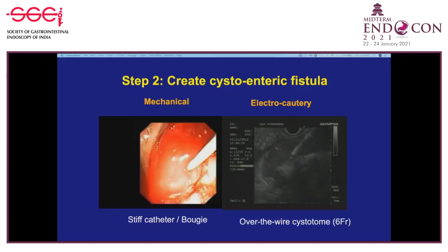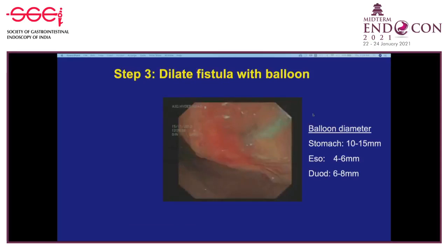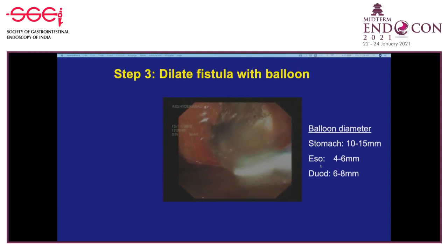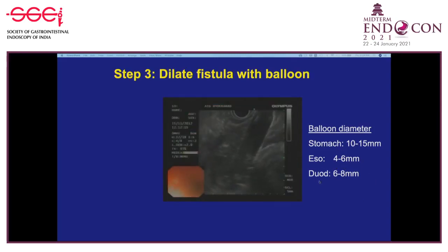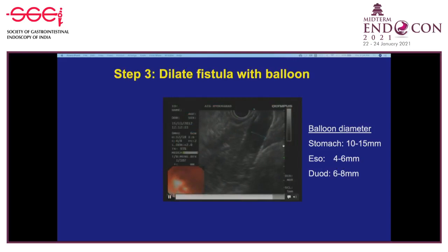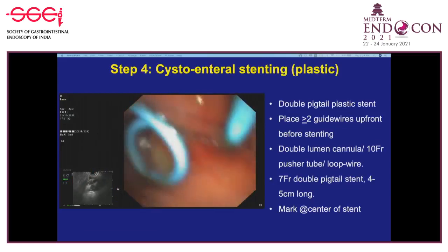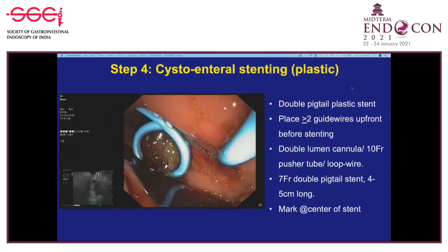After creating the fistula, it is dilated with a balloon. The caliber varies by location: in the stomach, a 10 to 15 mm balloon is used; for the esophagus, 4 to 6 mm is sufficient; for the duodenum, 6 to 8 mm. The balloon can be seen on EUS, and if filled with contrast, on fluoroscopy as well—though EUS is generally sufficient. If uncertain, pull back the scope and distend the stomach to see the balloon fully inflated across the wall.